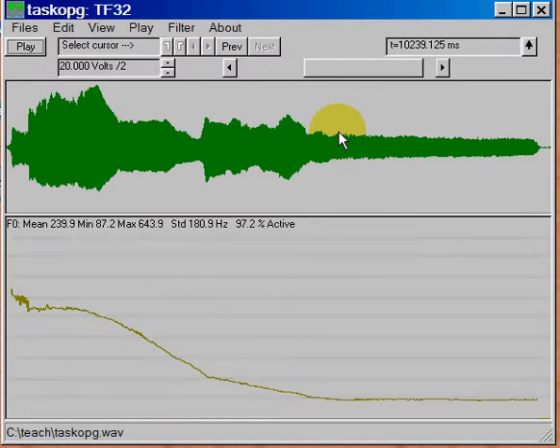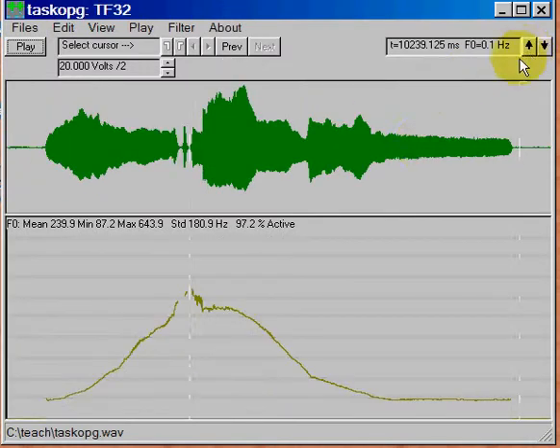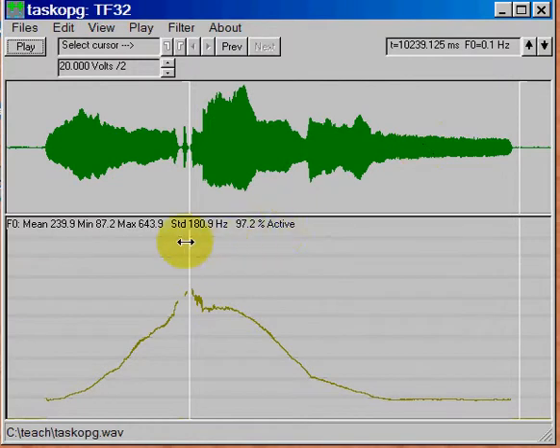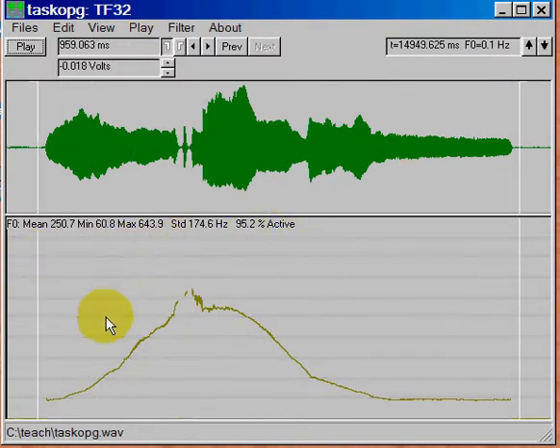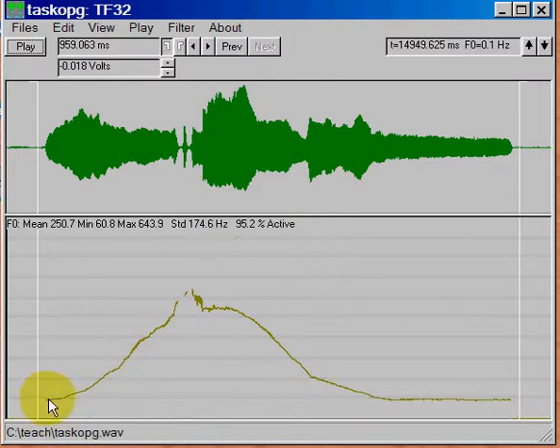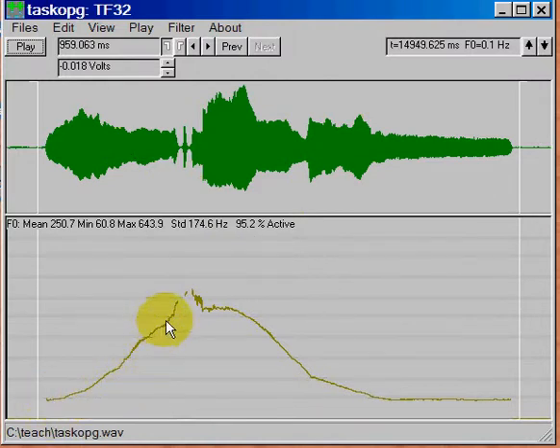And you can see here, and I'm just going to back this off a little bit. You can see here, if we look at the whole thing that's on here, we have our sound pressure level meter or waveform. And then we have, this is the fundamental frequency that's been extracted using a special algorithm.